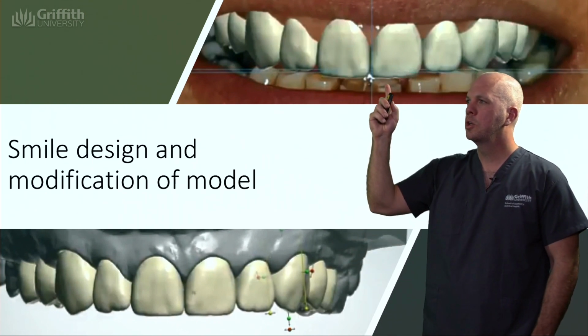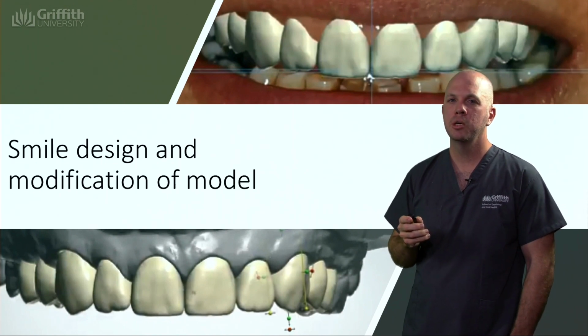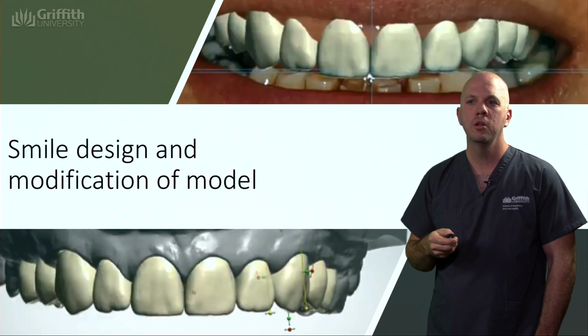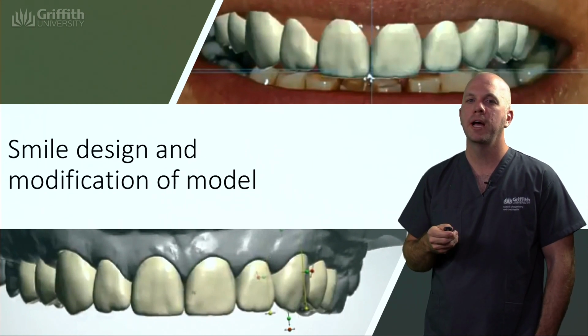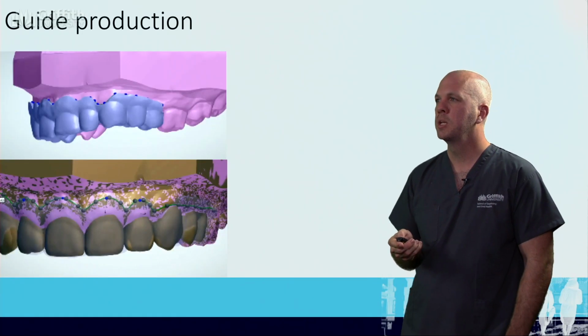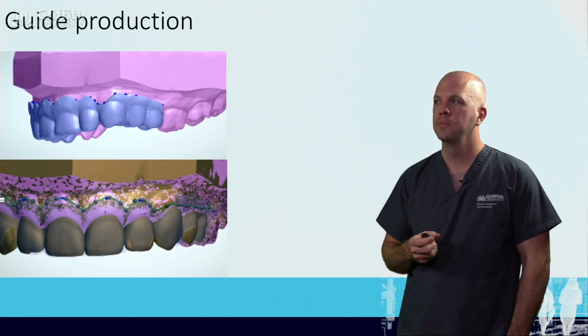We can also create some crowns. This is a really good technique because instead of doing the surgery and then hoping it's gone well, we can actually do the surgery in a specific guided way, and we can show the patient how they're going to look afterwards. In order to guide the surgery, we need to make a surgical guide though.